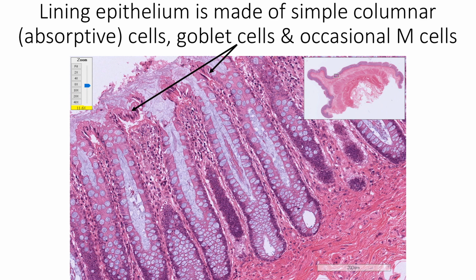Elimination of waste is helped by the abundant mucus which is secreted by the numerous goblet cells present here. In fact, number of goblet cells increase fourfold from the cecal end of the large intestine to the rectal end. A third type of caveolated tuft cells have been described close to the surface, but they may be the exhausted goblet cells.